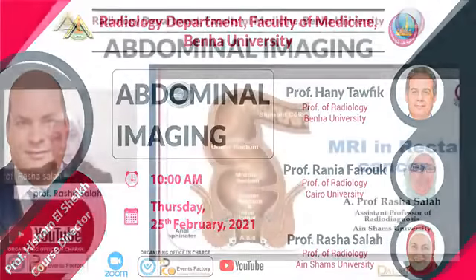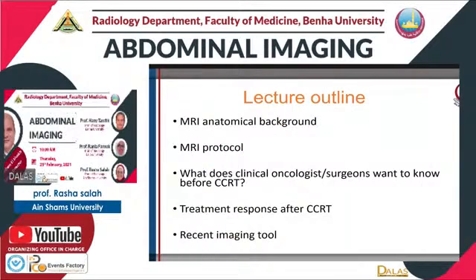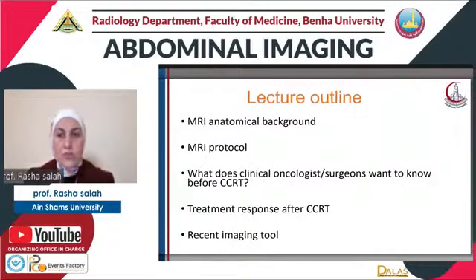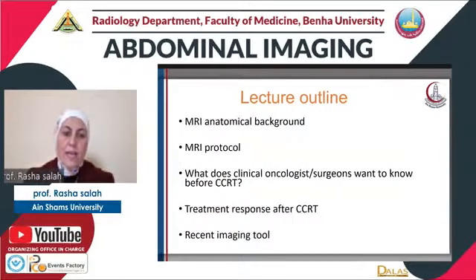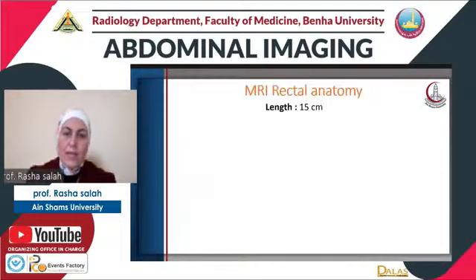Good afternoon. Today we are going to discuss MRI in rectal cancer. Today we are going to highlight the MRI anatomical background for the rectum, the MRI protocol, what the clinical oncologist and surgeons want to know before concurrent chemo and radiotherapy, and how to assess treatment response, and also we will highlight some recent imaging tools.